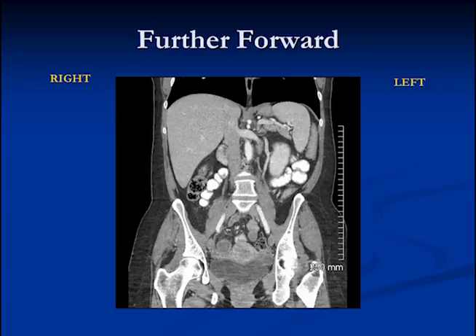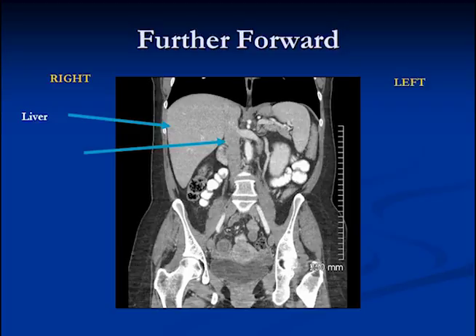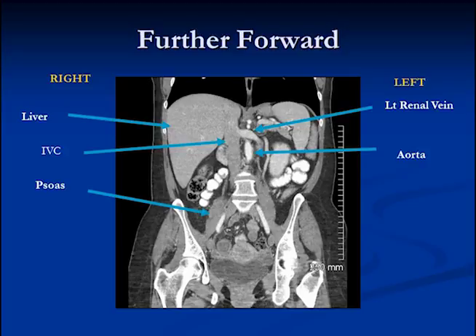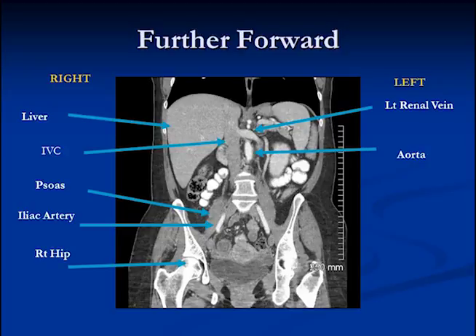Coming even further forward, we're going to see other vascular structures, still in the retroperitoneum centrally. Again the liver is visible here. This is the inferior vena cava, which courses through the liver as it goes up towards the heart. This structure coming across the aorta is the left renal vein. Sitting on top of the psoas muscle is this white structure, which is an artery — these are the iliac arteries, one on each side. This is the right hip, and again the spine.